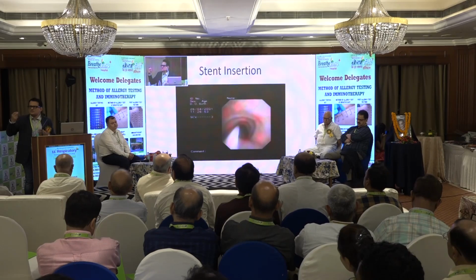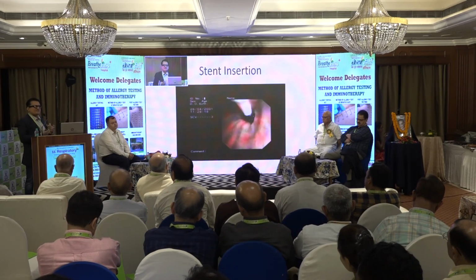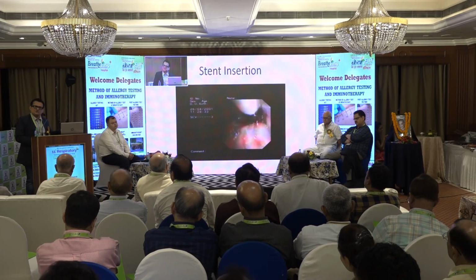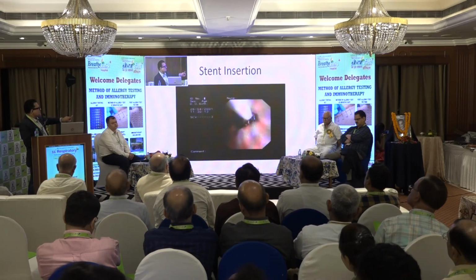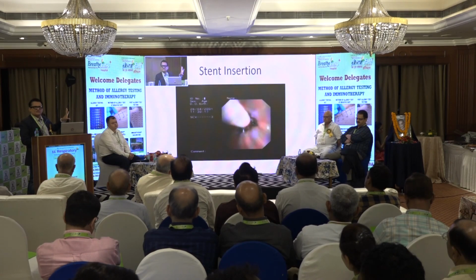Stent insertion was shown. If the airway is narrowed, compressed from all sides, we know that stent insertion, we think about coronary stent insertions. Airway stent insertion is also useful and possible in select patients here. What you see here is one of the first stents we did using the UltraFlex stent in 2001.